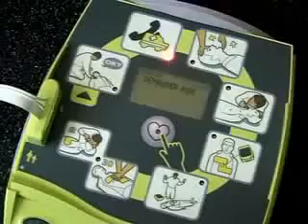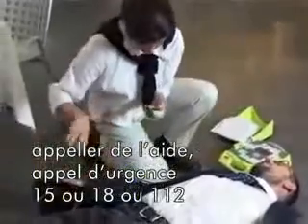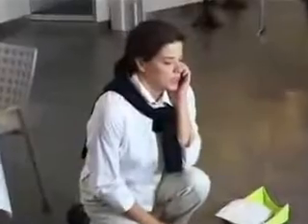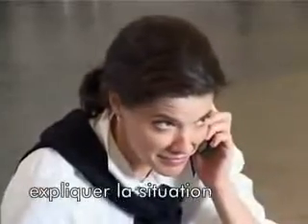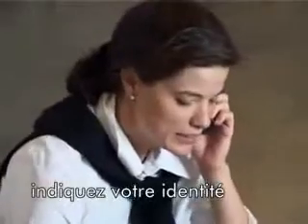Vérifiez l'état de conscience. Demandez de l'aide. Restez calme. Vérifiez l'état de conscience. Demandez de l'aide.